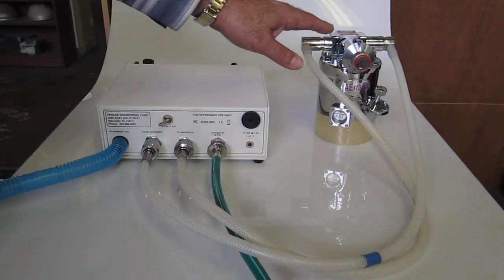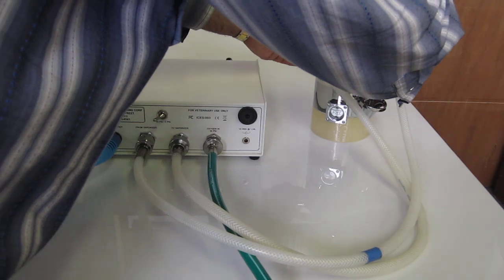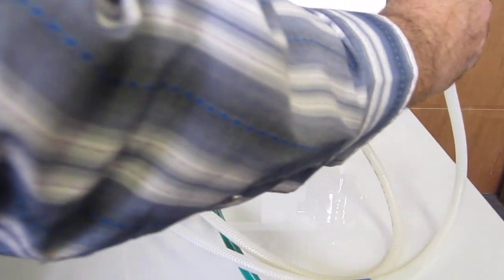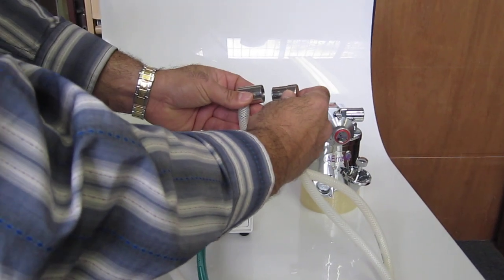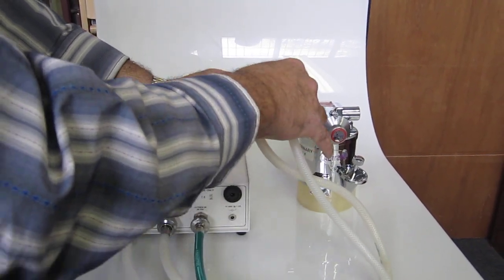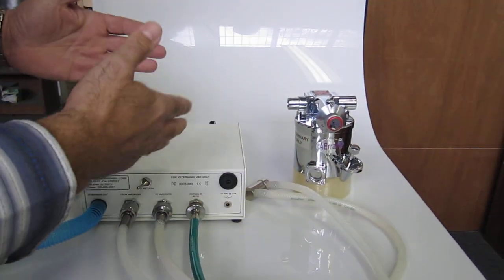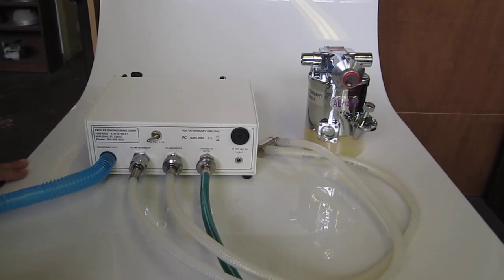If you do not want to have it hooked up to a vaporizer and you want to bypass the vaporizer to use it strictly as a ventilator, you remove the female and male connectors that are standard, and you connect them together, bypassing the vaporizer. This will now serve strictly as a ventilator and not as an anesthesia machine.